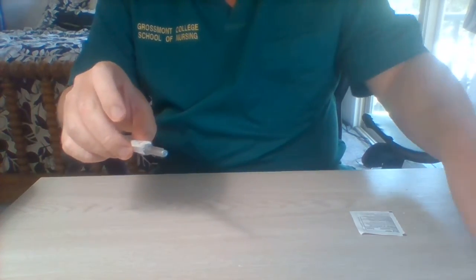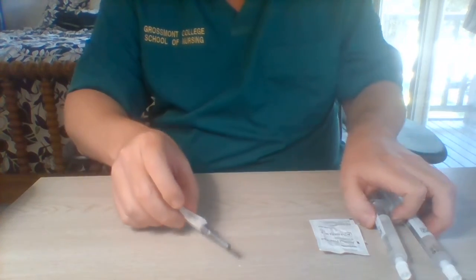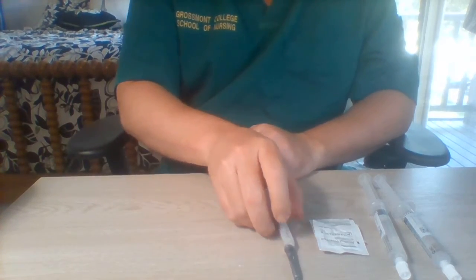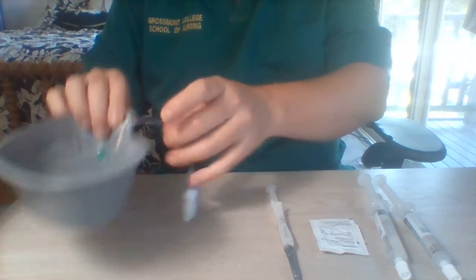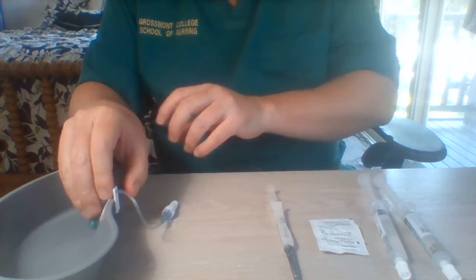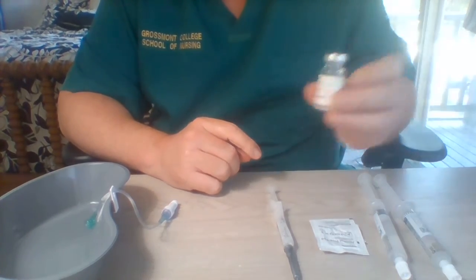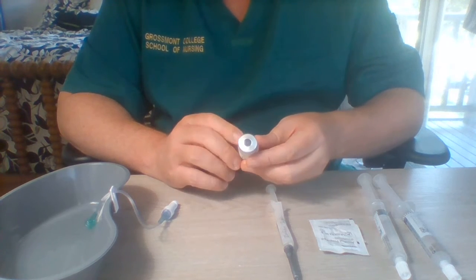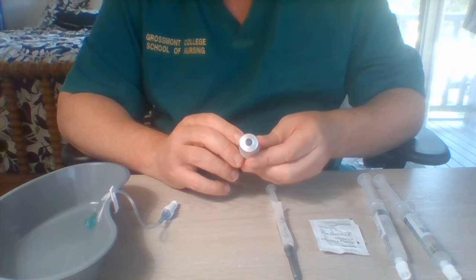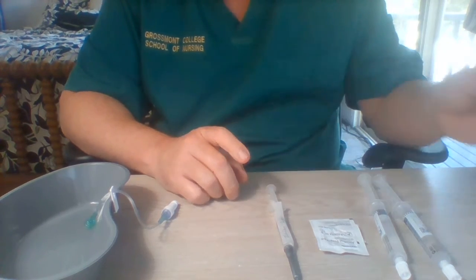Well, I need to gather equipment as well. So I need alcohol swabs, flushes, and the medication. And now I'm ready to go to the patient's room. Oh, one other thing that I needed to do when I checked the medication before drawing it is checking the expiration. The medication was not expired. That is something to check before even drawing the medication.